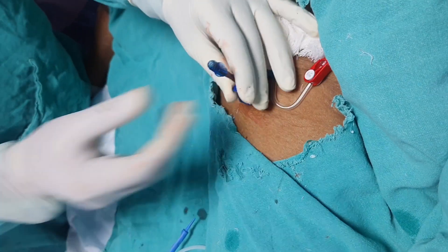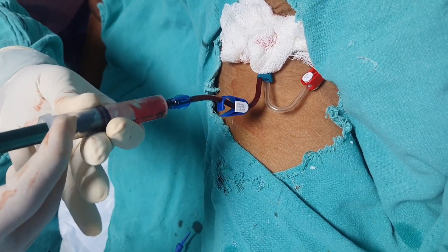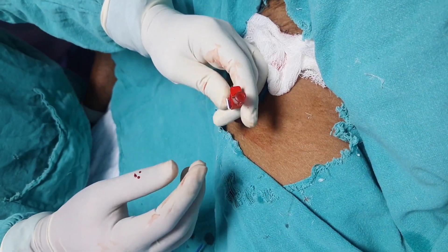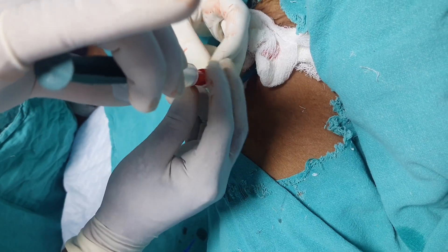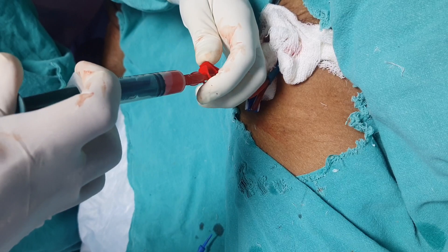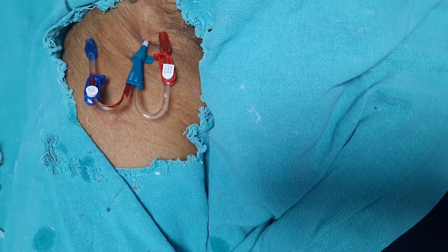Now we will check patency of both lumens by flushing with heparin-saline. Heparin will prevent coagulation. Remember we should not inject air, otherwise it can cause air embolism. The blue port is patent. Now we will check the red port — we will open the button and apply suction. Blood is coming freely. Since this is the dialysis port, a lot of blood comes with slight suction.